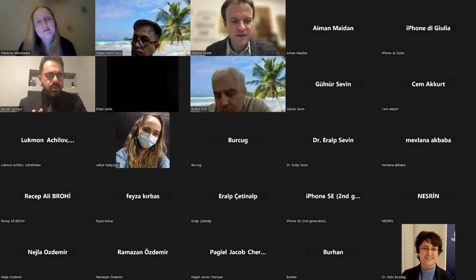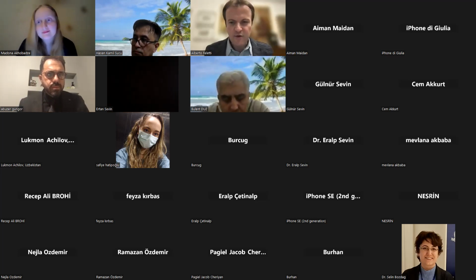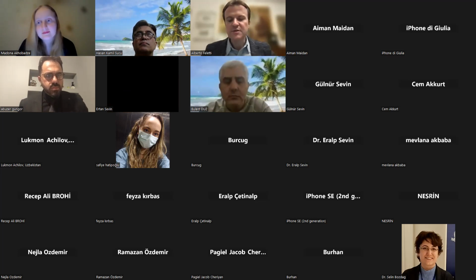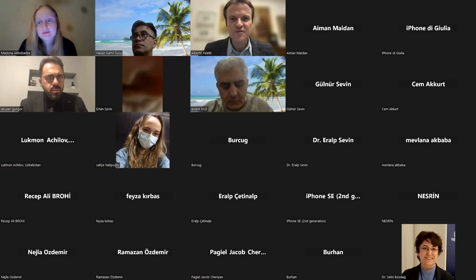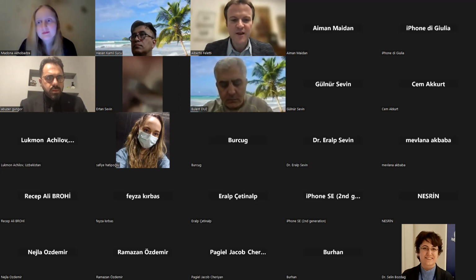Yes, thank you, Abuzer. Actually, you are right. Flexible endoscopy is not common in Europe. Actually, I would like to know also the situation in Turkey, if it is common or if it is used by someone. I would be interested, but I can say in general in Europe it is totally uncommon.